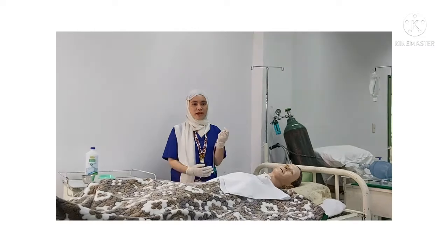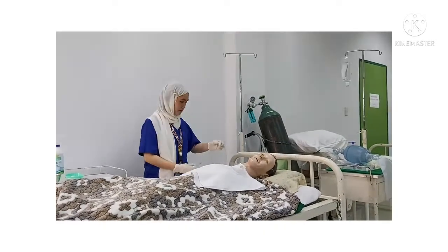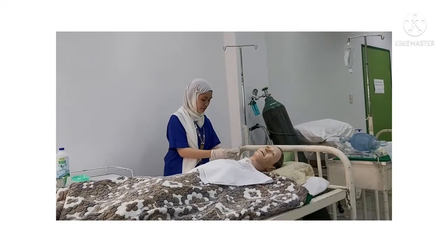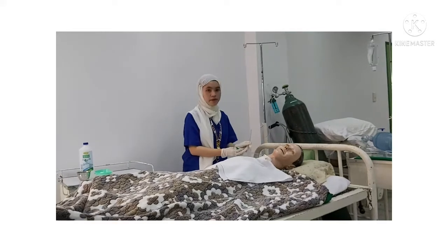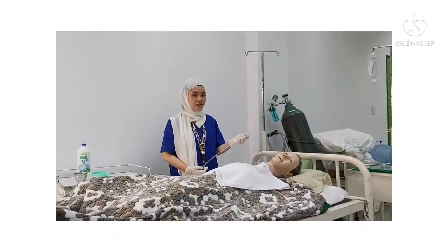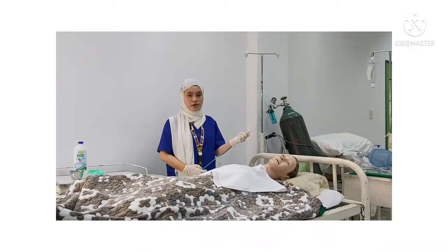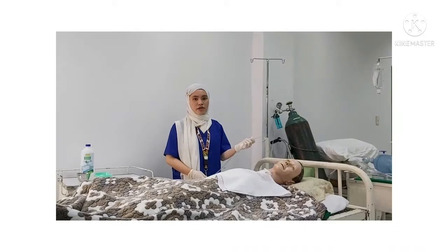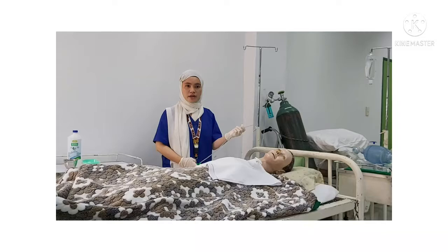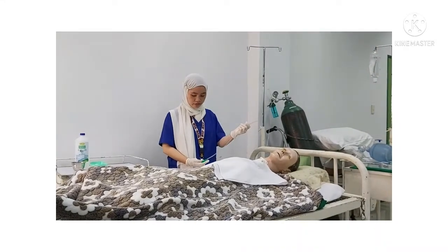And with the contaminated hand, attach the suction catheter to the connector. Turn on the suction machine and test patency with saline solution or sterile water. Place the gloved finger over the Y connector to create suction.